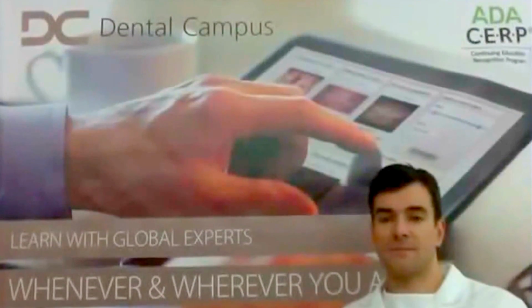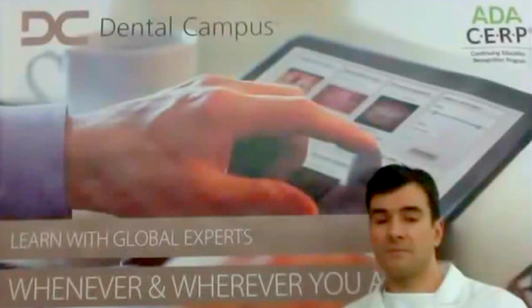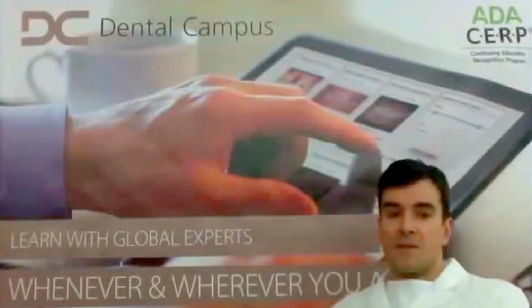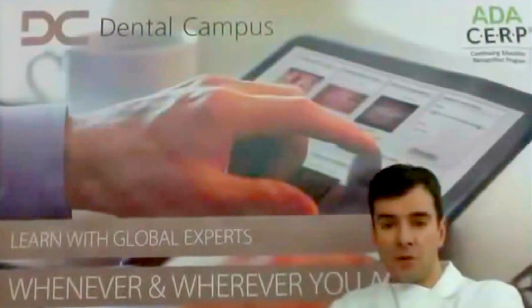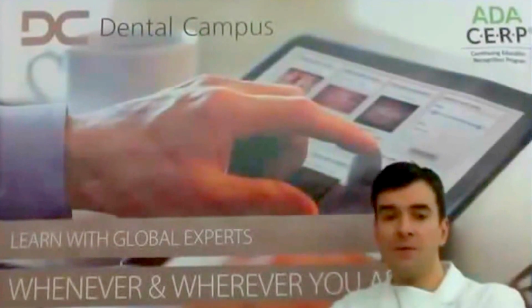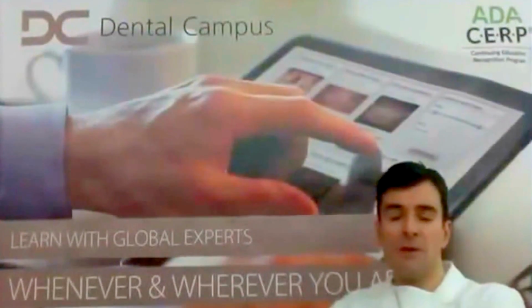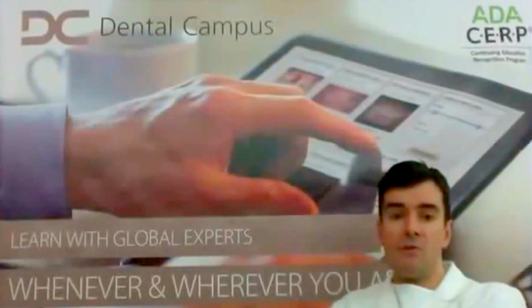Okay. So what is the minimum height of bone in the maxillary posterior region you feel comfortable to place an implant and doing sinus lift together? So this really depends a lot on the preference and on the surgeon. So there are a lot of people who do this procedure even with 1 or 2 millimeters of bone. In my opinion, this is not very predictable. It's very risky. So my number is rather 3 to 4 millimeters.